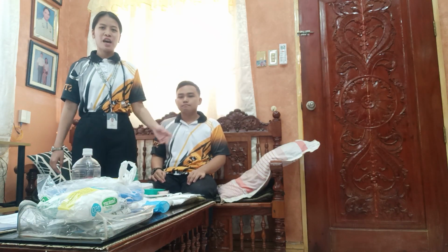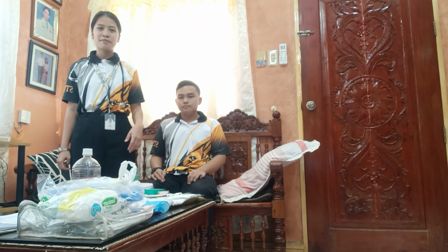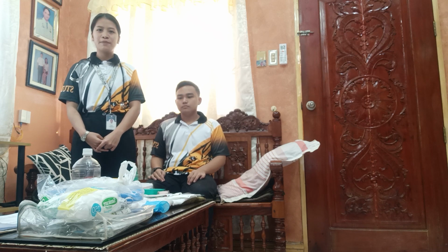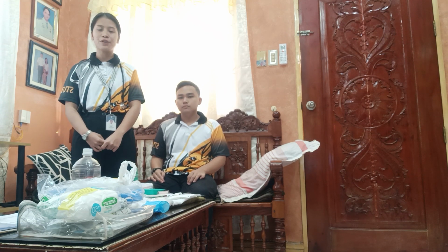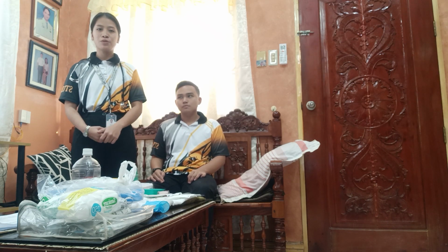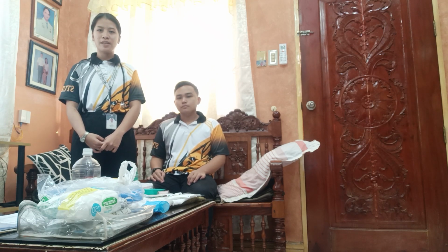Good day, ma'am, sir. Now I will be performing the NGT insertion. So the purpose of this assessment is, this is a type of tube that permits patients to receive nutrition through tube feeding, using the stomach as a natural receiver for food. And also, another purpose of the NGT tube may be to decompress or to drain unwanted fluid and air from the stomach.